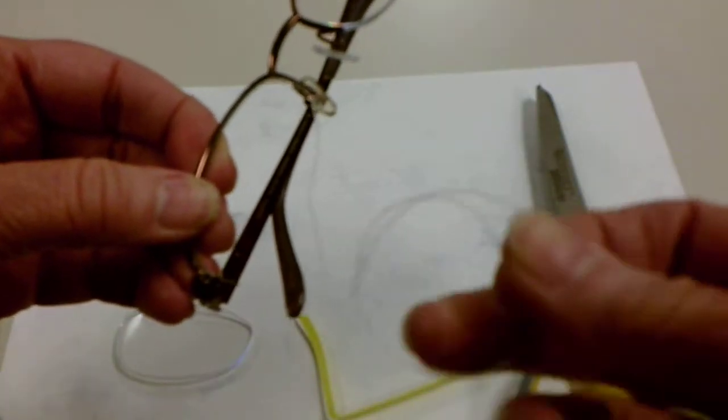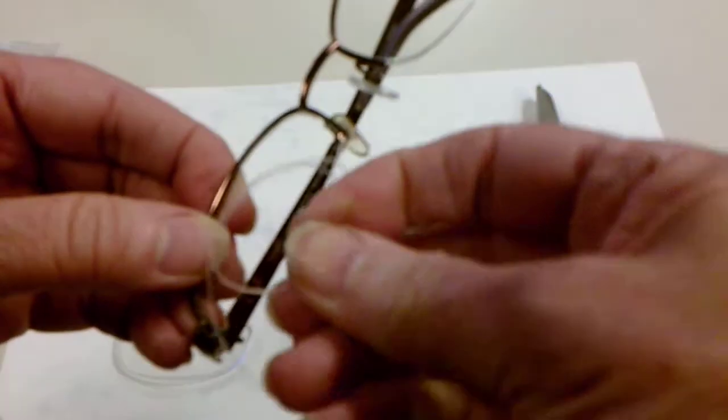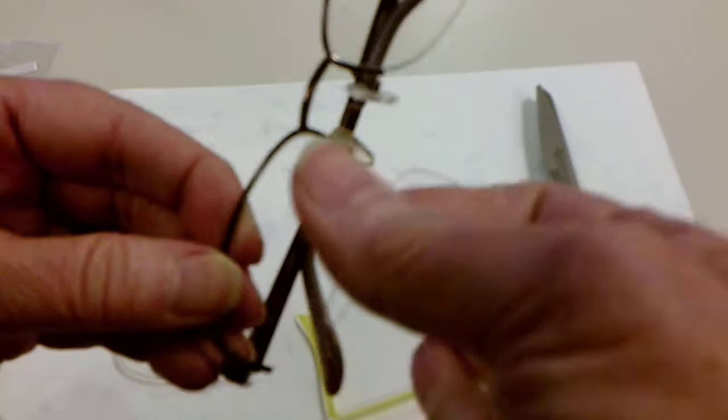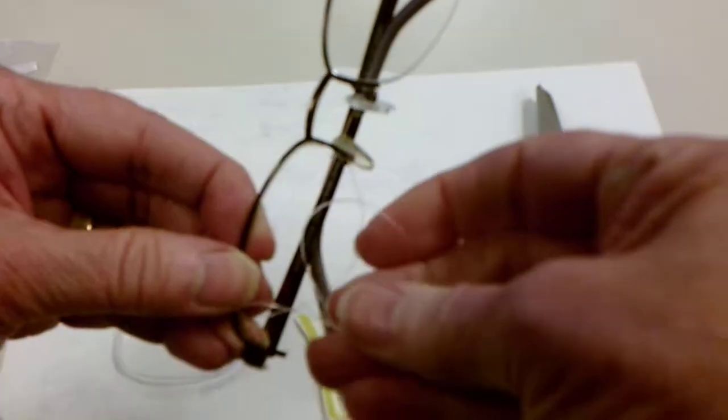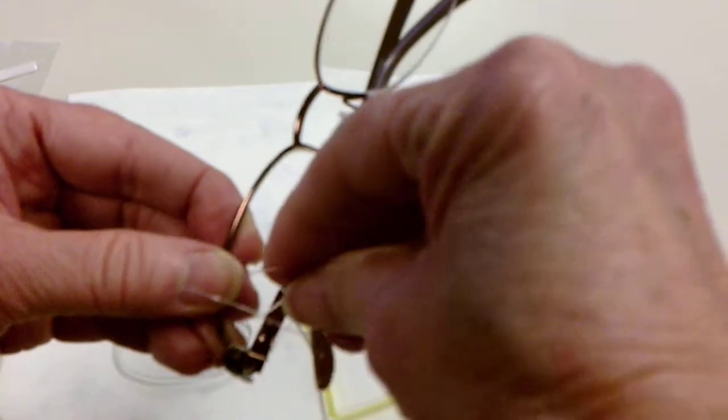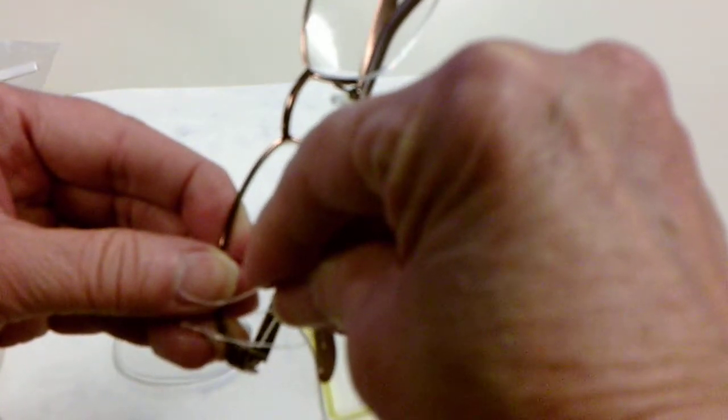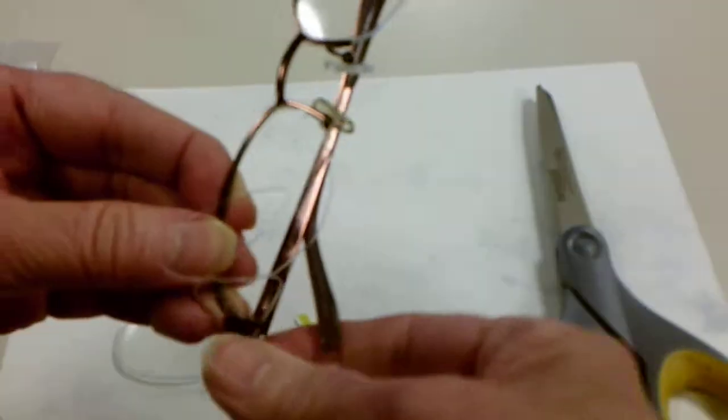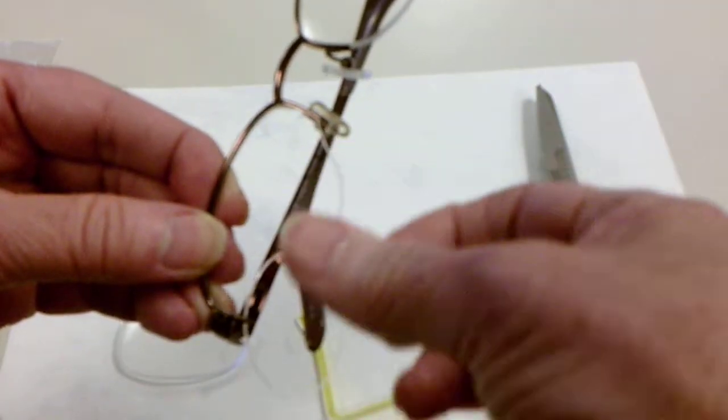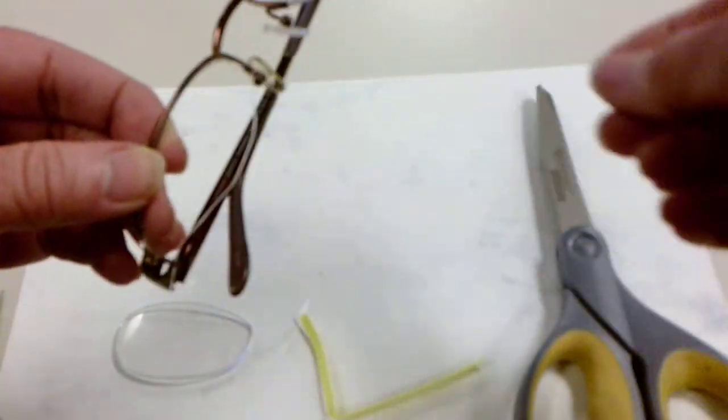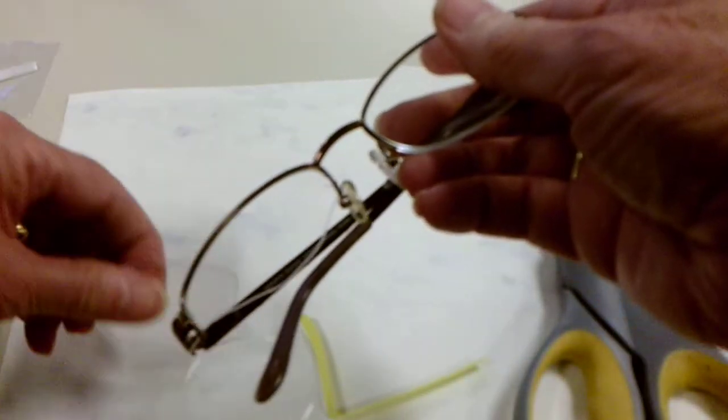Then we're going to come around to the outer hole. Sometimes it's hard to determine how long to make the string, but this is easy peasy. Go ahead and put it through one of the holes.